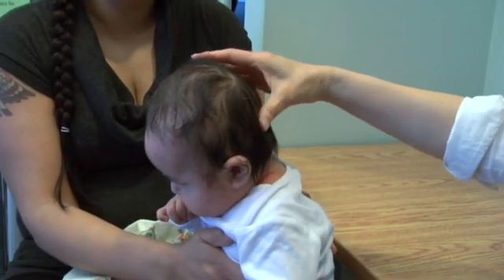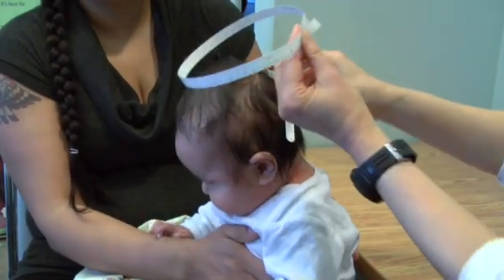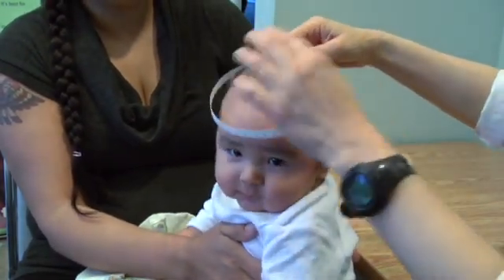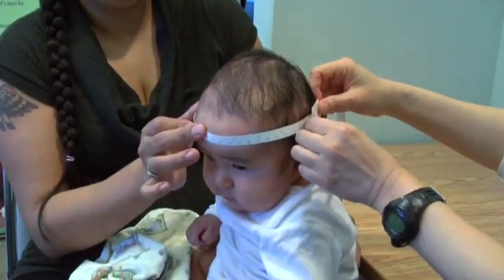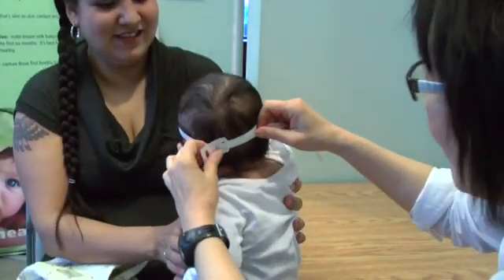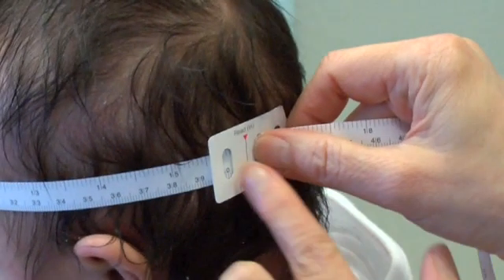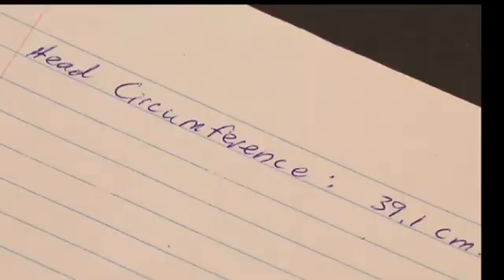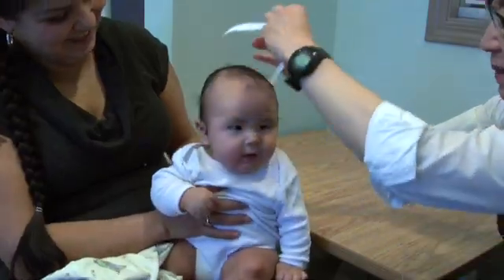To measure head circumference, seat the infant on an adult's lap keeping the infant's head still during the measurement. Use a flexible, non-stretchable tape measure. From the bony protrusion on the back of the head, bring the tape around the head and position it just above the eyebrow, above the ears. Measure to the nearest 0.1cm. If possible, repeat the measurement three times to ensure the largest circumference and the correct reading is recorded.